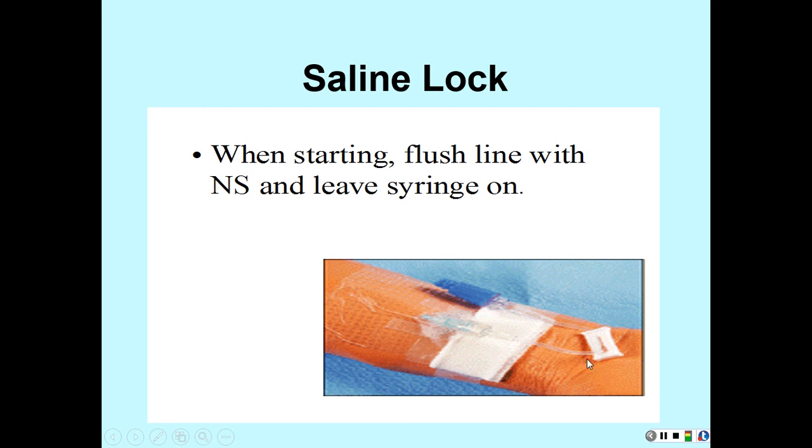And we also use these even when we're starting an IV, because a lot of times once IV fluids are DC'd, you may be ordered to leave the saline lock in or convert it to a saline lock. So in that case, all you have to do is unhook your fluids from here, and you still have a saline lock. Used to, we'd have to take the IV tubing off from right here and cap it right there. Now you just unhook it right there, flush it, you're good to go.